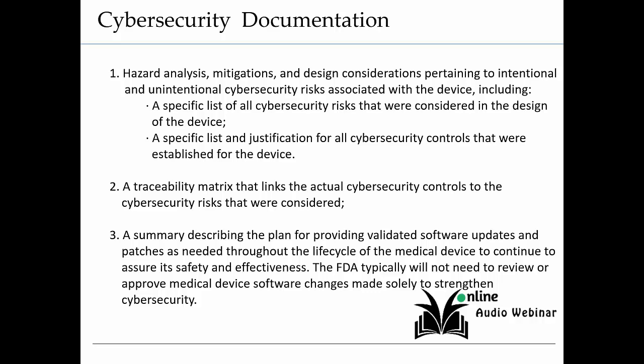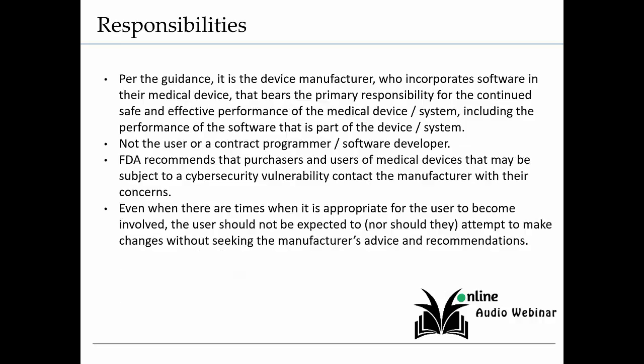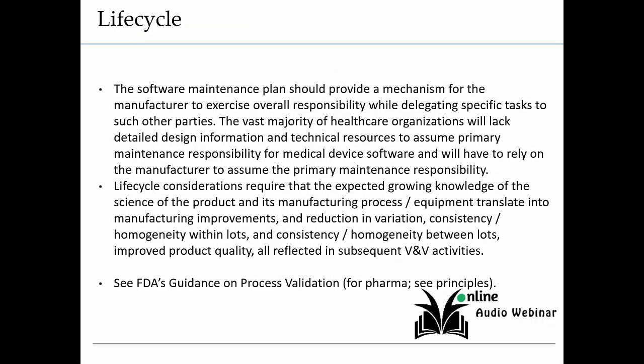Now, cybersecurity: when you're dealing with a SAMD, you will be dealing with cybersecurity issues because they can or are connected to the internet. So you have to consider you as the ultimate manufacturer, you with the name on the label, are ultimately responsible for all of this. And same again, life cycle from cradle to grave.